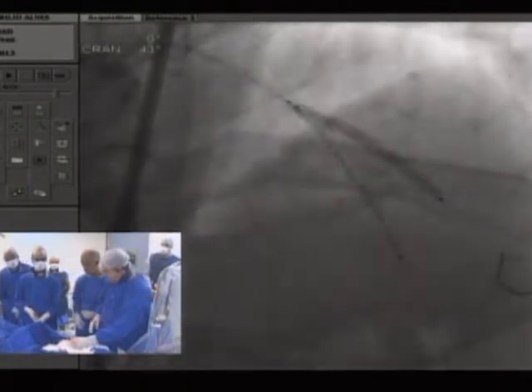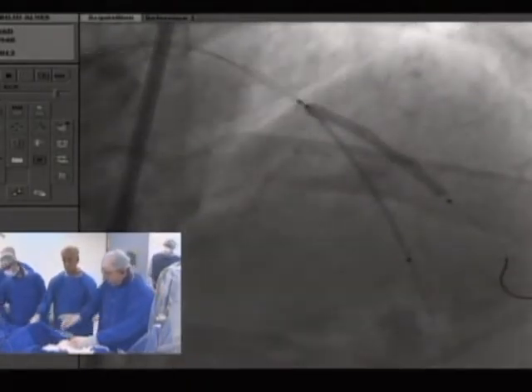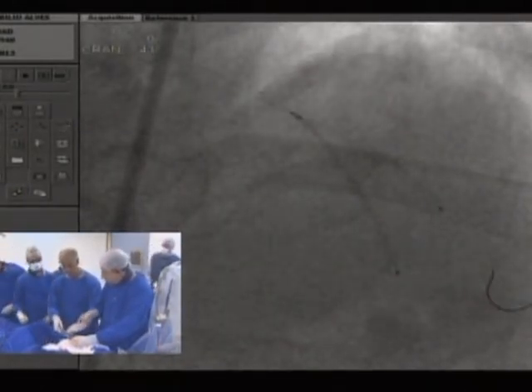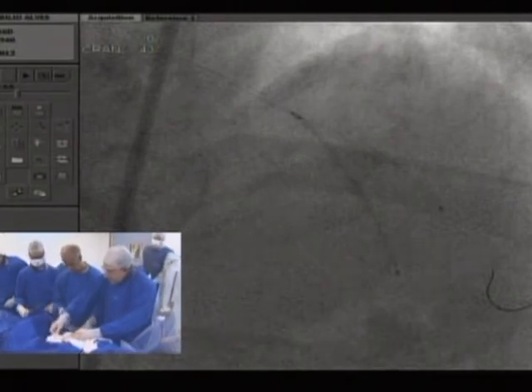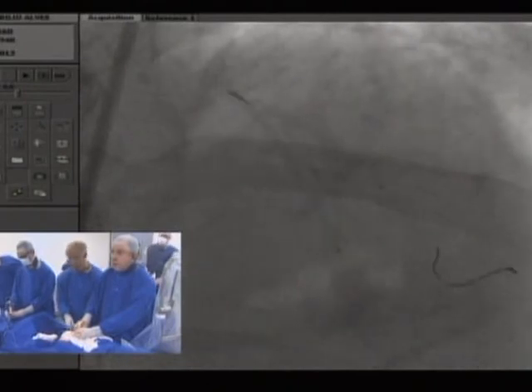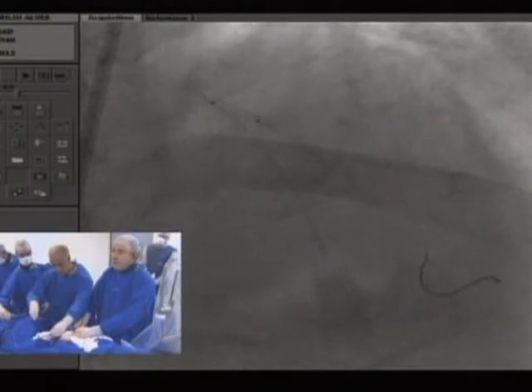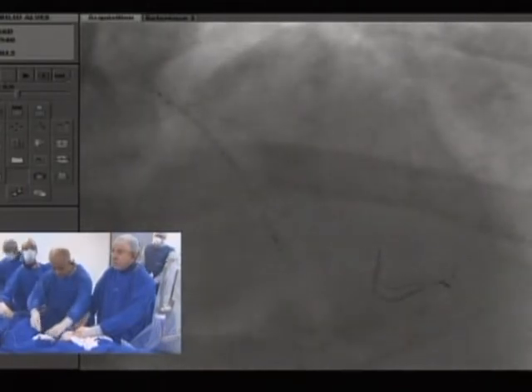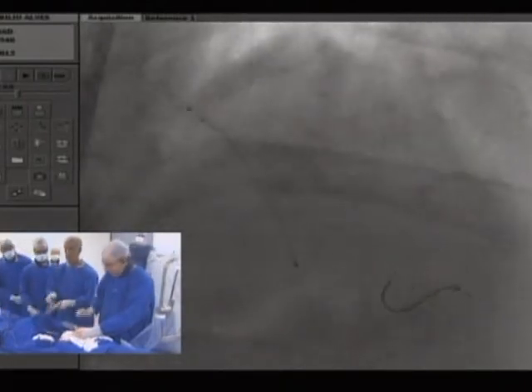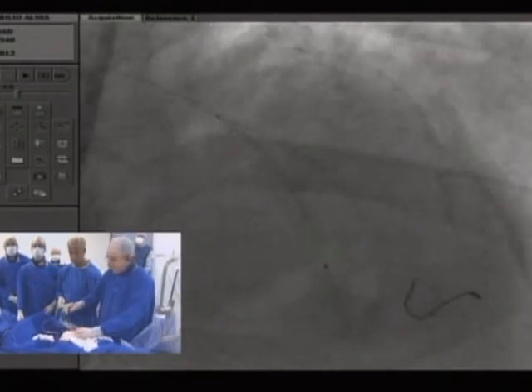So he decided. He's doing the case. You deployed the first one in the diagonal. That's a very important step now, to pull the balloon back. If you keep the balloon in, oh my gosh, you're going to have a problem. It's going to be trapped.